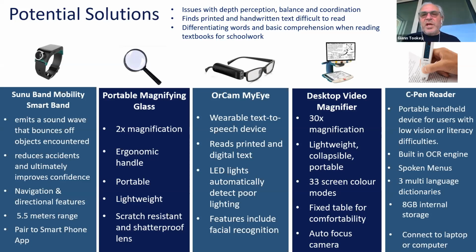And also, Ruth, a child knows it's been scanned basically when they stop drawing it over the text. It's collected everything they've run the device over. It records it as you pull it across the paper. As soon as you pick it up, it's then going to work with the text that's been scanned. So it doesn't need any control. It's really just point and shoot as a device.